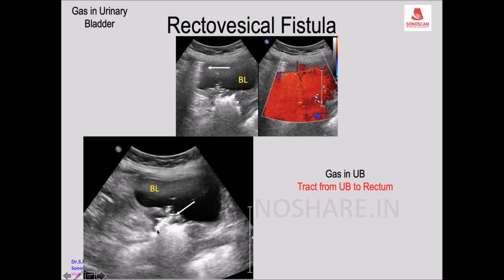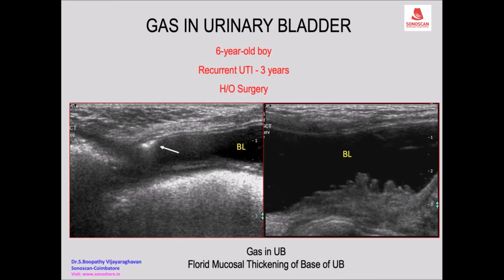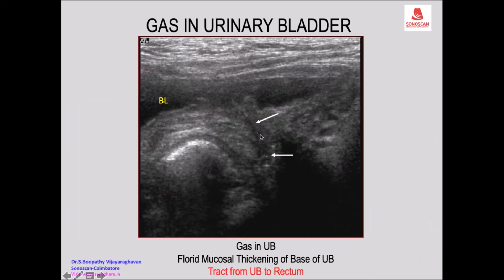A tract from the bladder to the rectum indicates a rectovesical fistula. If you see closely, when you look for the bladder you see florid mucosal thickening in the left side of the base of the urinary bladder. When you look carefully at the posteriorly placed rectum which contains gas, this may be a fistulous tract from the bladder to the rectum - a rectovesical fistula.